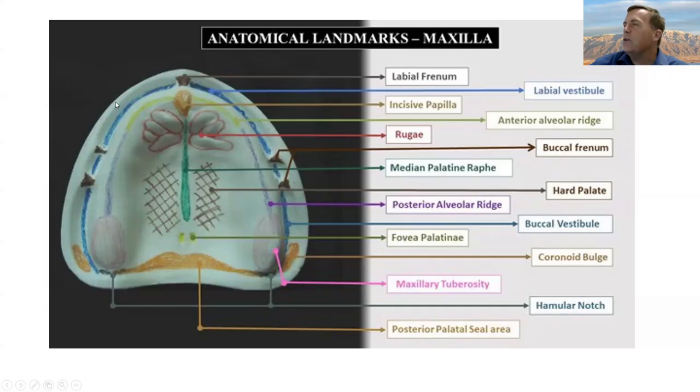One of the things you can do to evaluate is, most laboratories, when they make the base plate for their bite block, will set the borders where they think the denture ought to be. So when you're looking at your base plate and you think, oh, that's a little short, that's a good time to say, hey, I think we're missing this or that area. And then you can revalidate that when you do the try-in.